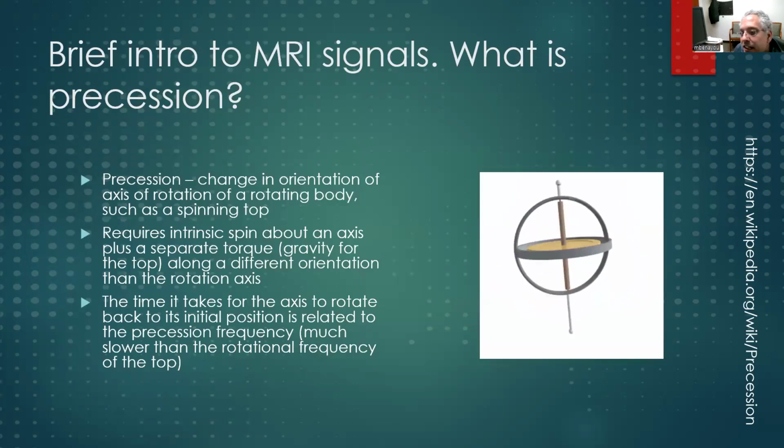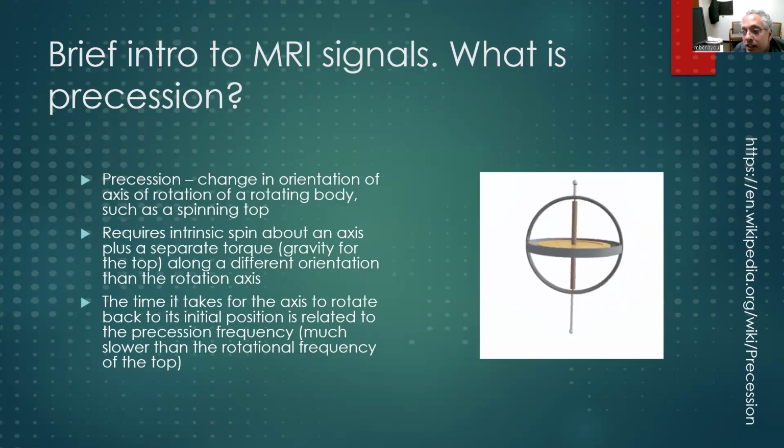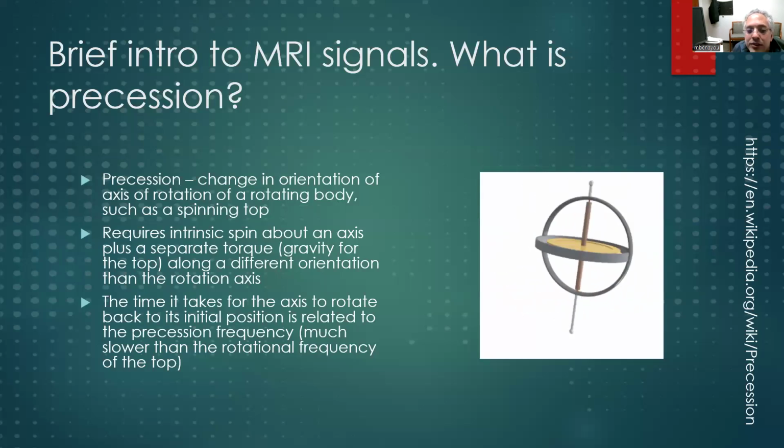So the basic thing we talk about in MRI, and it will apply to fMRI as well, is that when you put the body in a very strong magnetic field of an MRI, like 3 Tesla or more, protons, the hydrogen nuclei in the various atoms that comprise the tissue of the body and the brain, in this case, will align their intrinsic magnetic moment with the magnetic field of the magnet itself in the MRI. And then they actually end up precessing around this magnetic field.